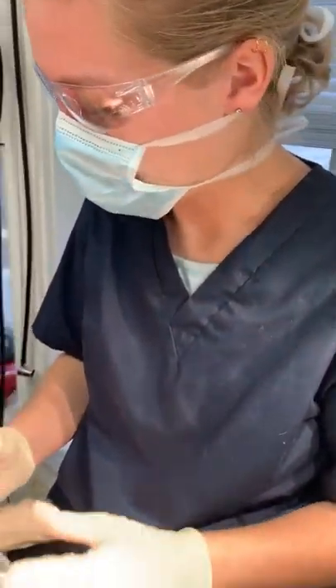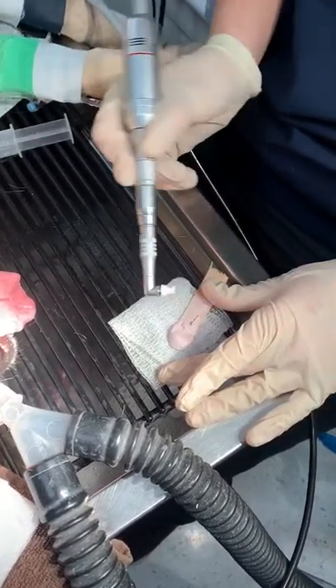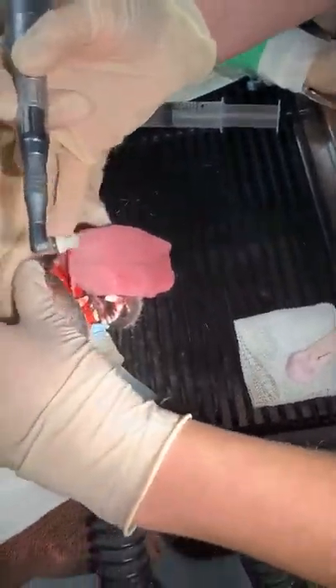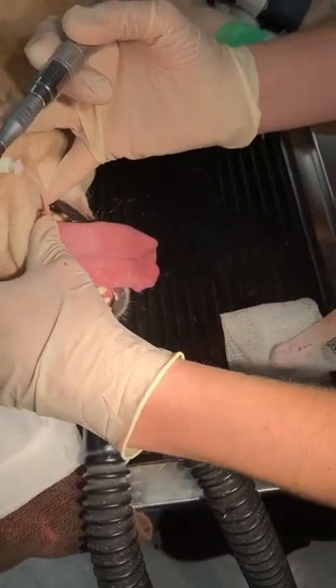All right, so now we're going to do some dental polishing. I have my polisher here and I have the polish on a broken-off tongue depressor. I'm going to scoop up the polish and put it right in the pocket there. I'm going to start with these back teeth — they're always the hardest to reach. Excuse the bottom ones because I didn't scale those yet; I'm just demonstrating this for the video.